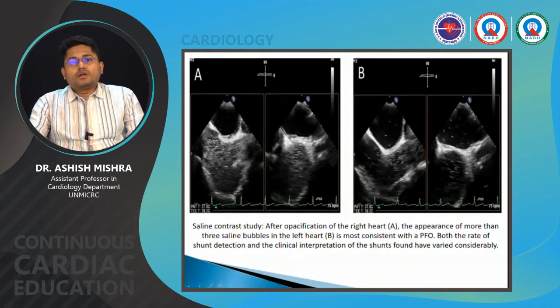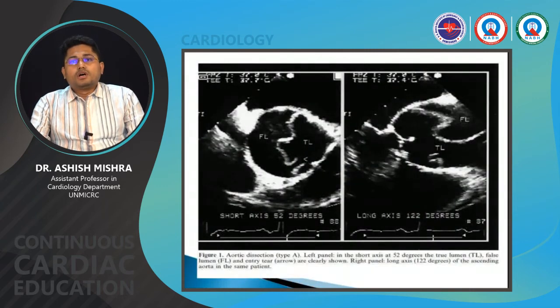So in this patient, the saline contrast was given, and there was appearance of more than 3 saline bubbles in the left heart, which was consistent with a diagnosis of PFO, and the patient later underwent PFO device closure. These are some of the images from the test.